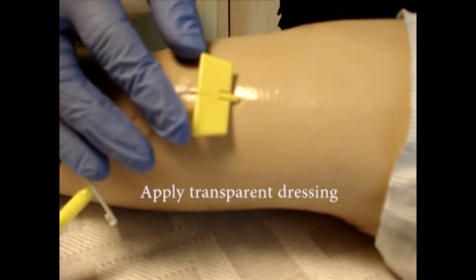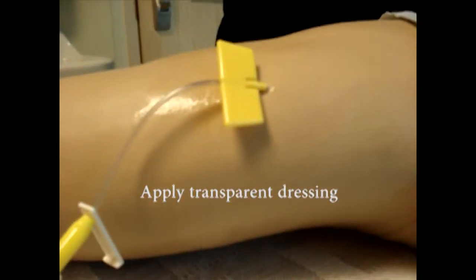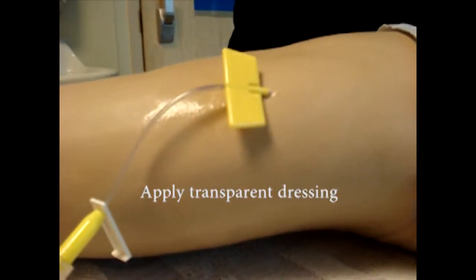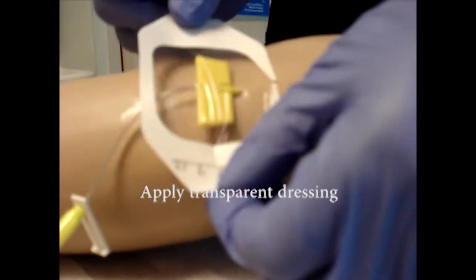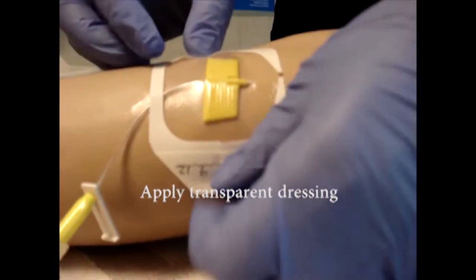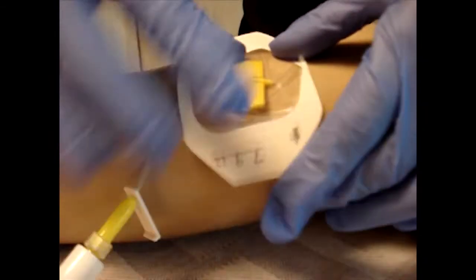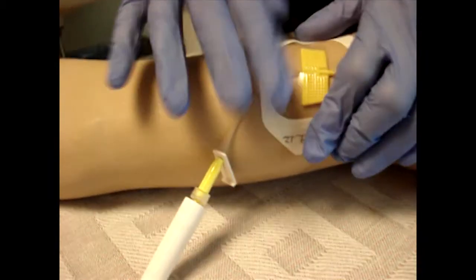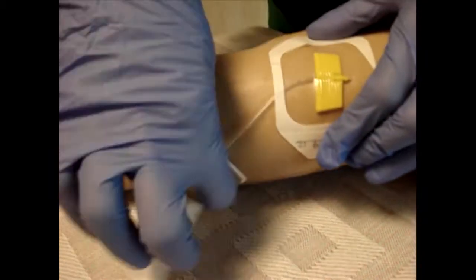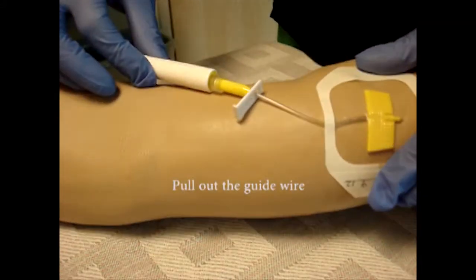Apply transparent dressing. Grasp the white end and gently pull out the guide wire.